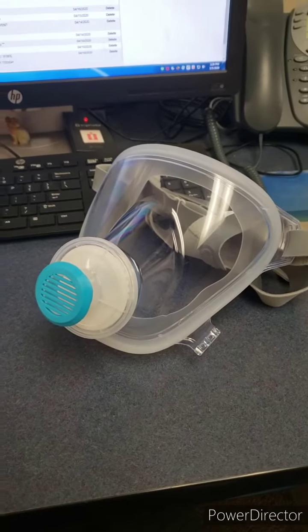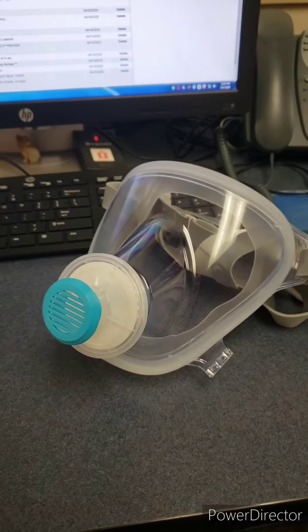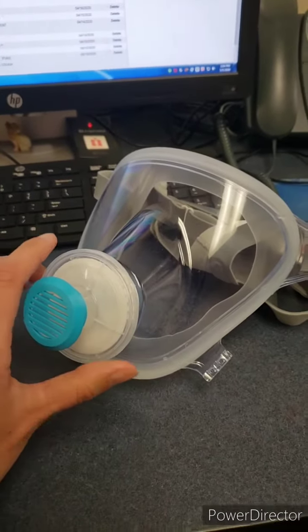Welcome to your training on your Philips Respironics FitLife Total Face Mask, otherwise known as the Fireman Mask or the Hot Face Mask.